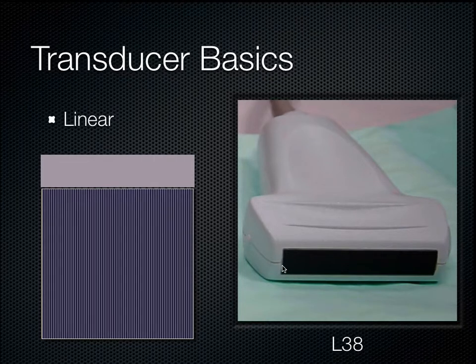They make all different types of linear transducers. Generally speaking, these tend to be higher frequency transducers that are used for the first few centimeters of soft tissue. Anything greater than 5 or 6 centimeters of tissue, you're going to need to switch to another transducer. So this is all the near field stuff. Think about soft tissue cellulitis versus abscess. Think about DVT work, vascular access, all the musculoskeletal functions such as looking at fractures, reducing fractures, joint effusions, tendon ruptures, nerve blocks, those types of procedural guidance, things like that.